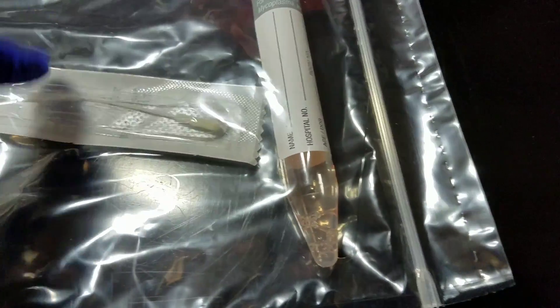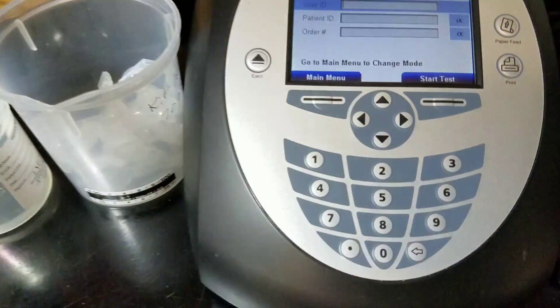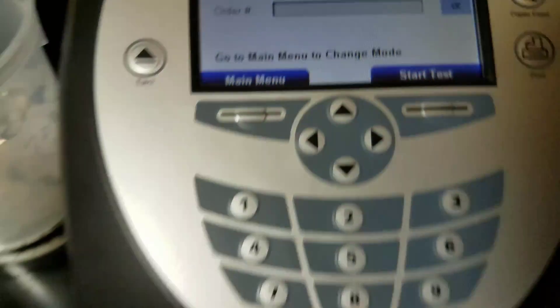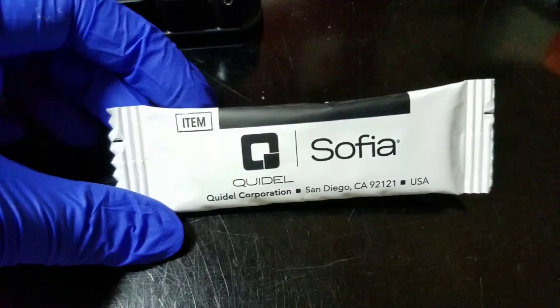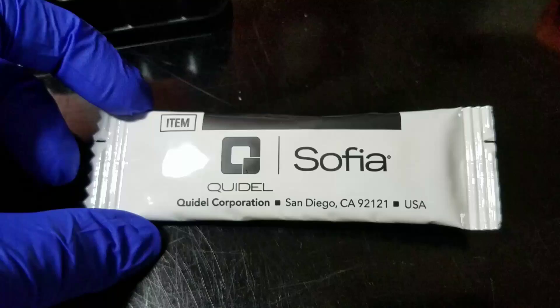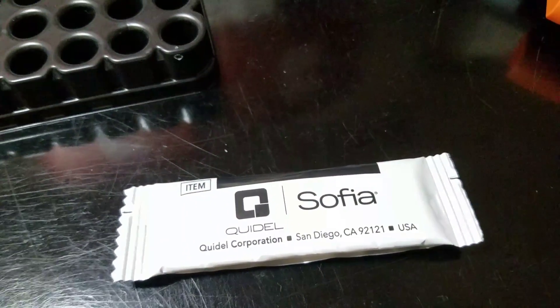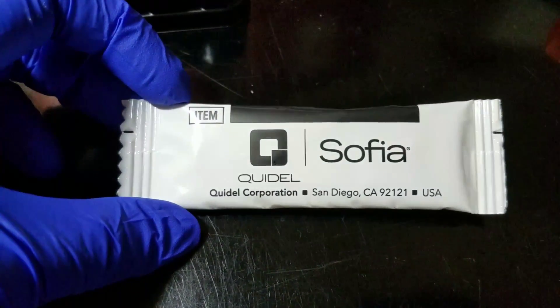Once the swab is swabbed, it will go inside this container. The testing that we do is by Quidel and it's called the Sophia. Here's what the cartridge looks like. Some other processes, you could see the line and it would actually read it. But with these, there are no visible lines to the human eye — it actually detects it by a higher scientific process.